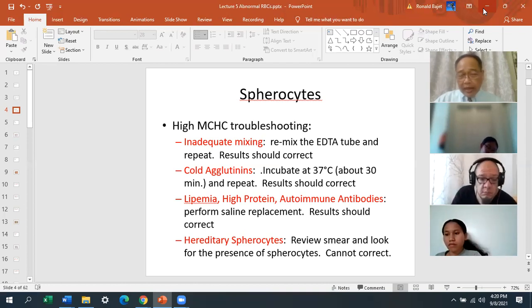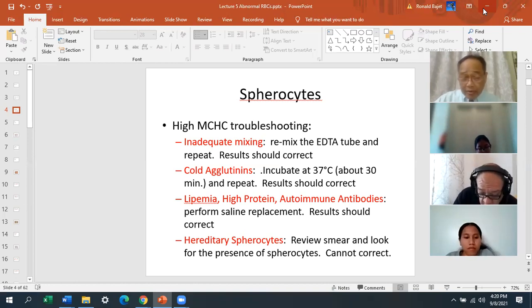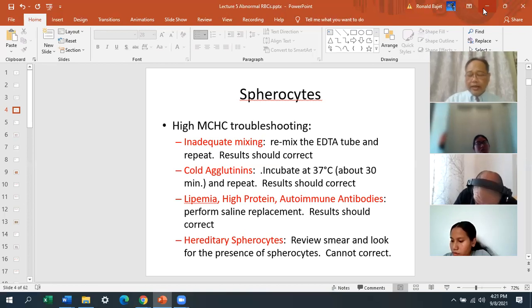I told you, you can get a high MCHC. It'll probably be about 37 or maybe 38 at the most. You can't correct for those. Okay, so you'll repeat it and it won't correct. The rule of threes will probably pass, but when you look at the smear, then you'll see that you're actually dealing with spherocytes. So those are instances where you will have high MCHCs. Remember, normally, with the exception of spherocytes, a high MCHC is not reportable, and you have to resort to troubleshooting.